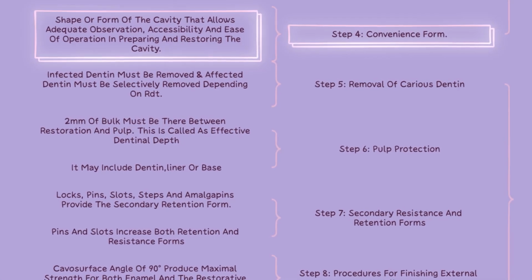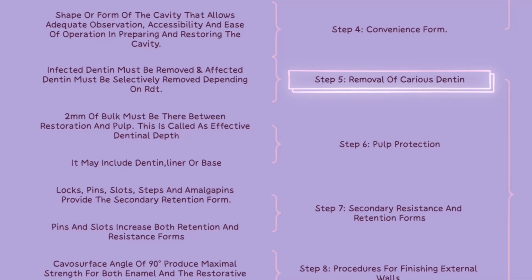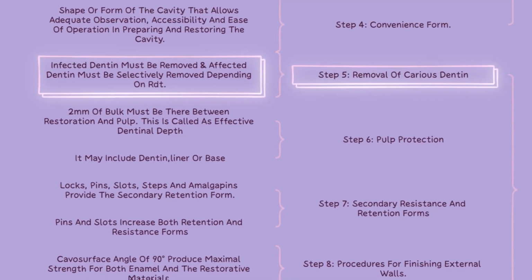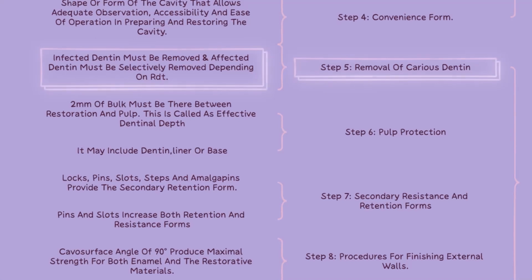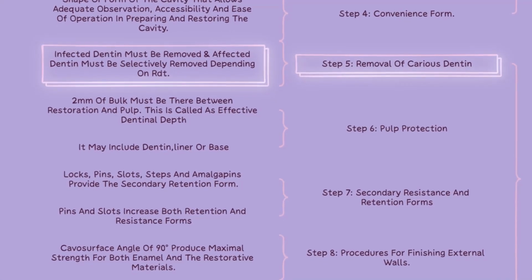Moving on to the final steps of cavity preparation, we have removal of caries dentin. Infected dentin must always be removed, while affected dentin can be left behind in the cavity preparation, depending on the remaining dentinal thickness. One must be careful while distinguishing between the two.